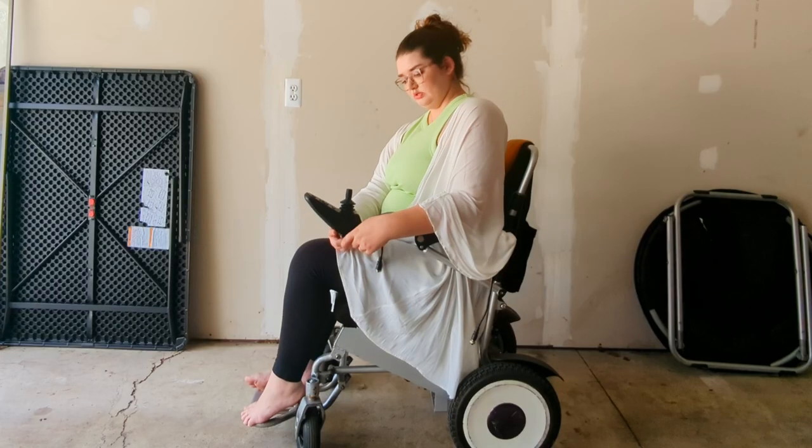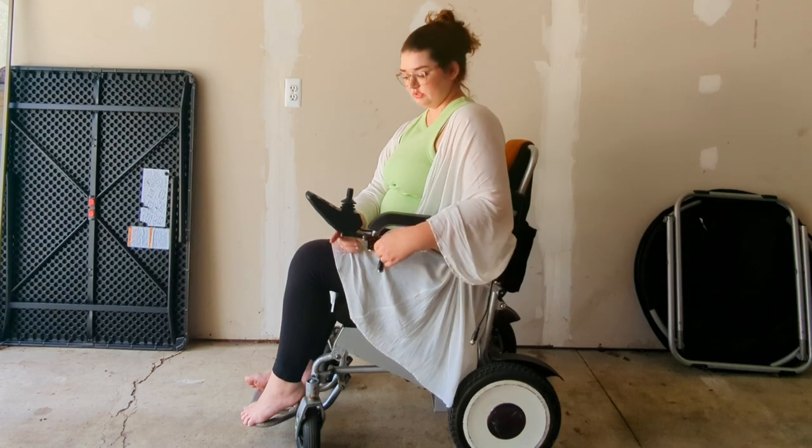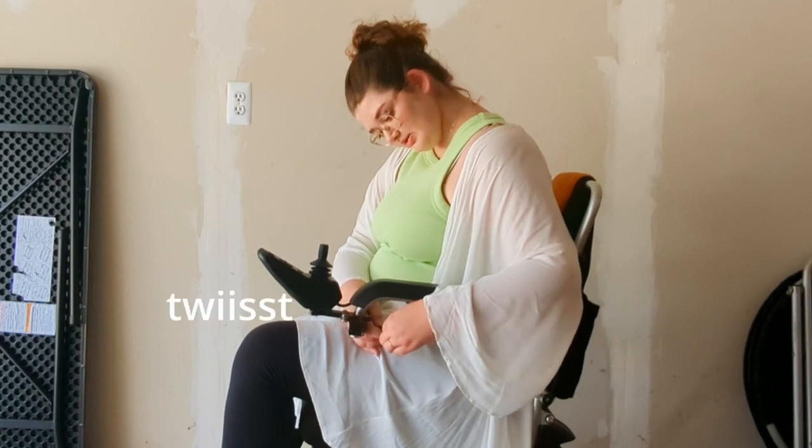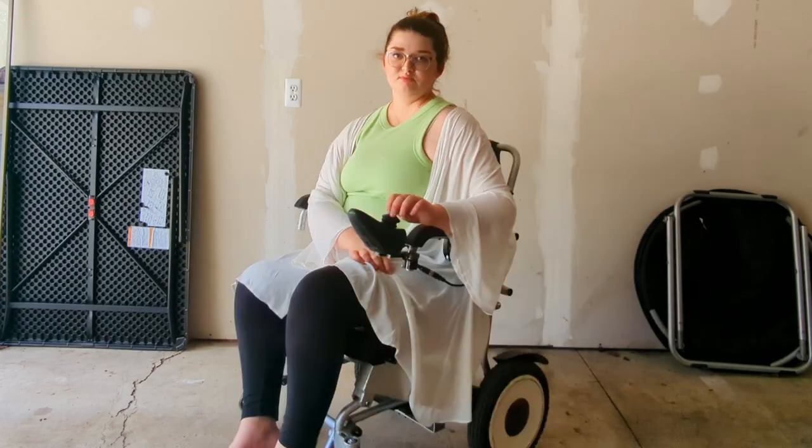So I don't want to give them the opportunity to destroy my legs. And then you twist it, twist it, twist it — power is restored and I can move again.